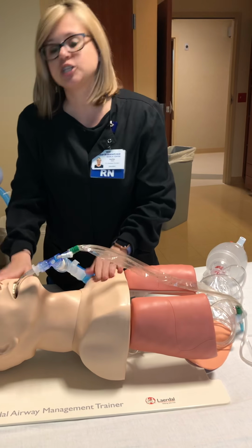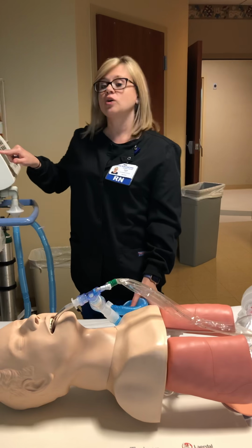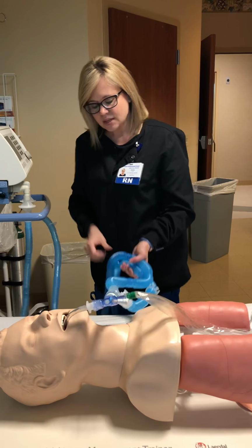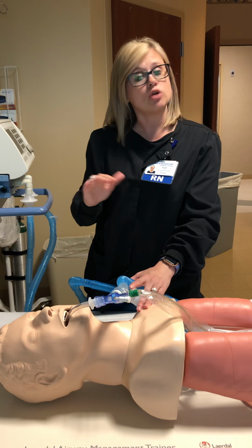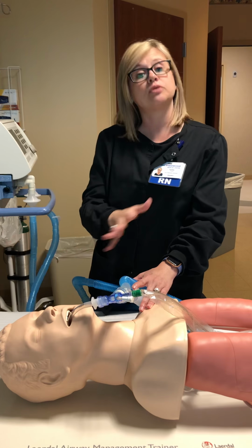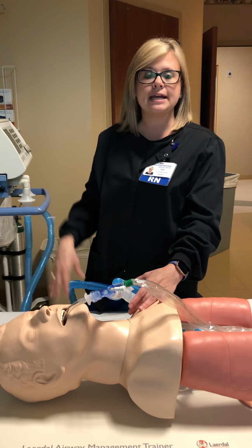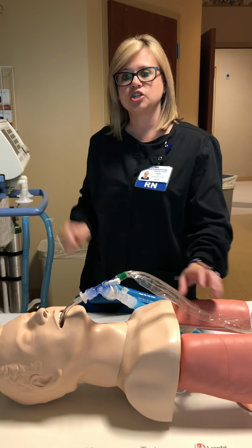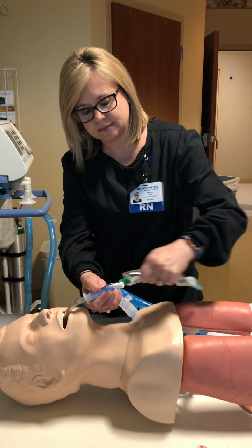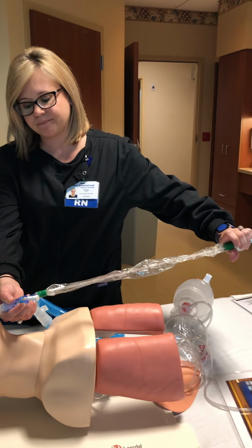After you do that, the patient will probably cough, gag, their oxygen saturation may drop. If it does, you can go ahead and give another O2 breath. The patient may need to be suctioned again, but if their oxygen sats are low in the 80s, don't suction again. Let them get the O2 breath and recover and see what's going to happen. If they recover and their sats do go back up to 88, 90% and they still have secretions, then start the process again. Pre-oxygenate, make another pass, and then intermittently press the button as you withdraw the suction catheter.